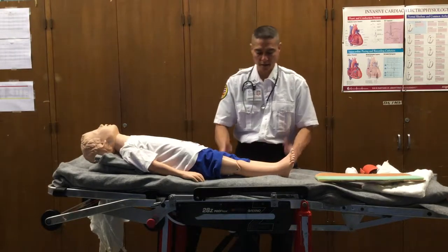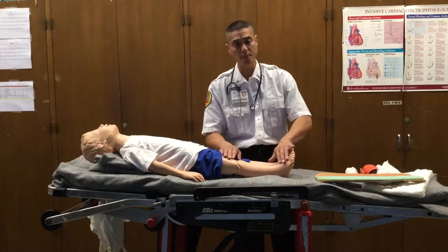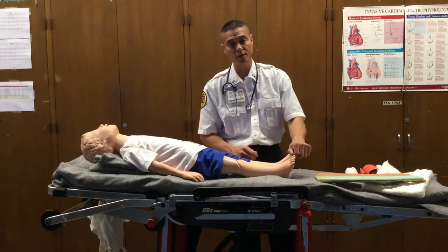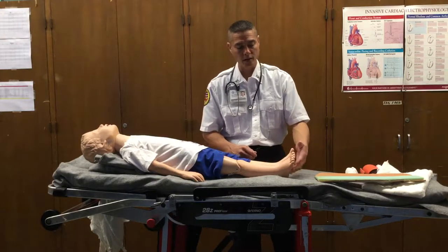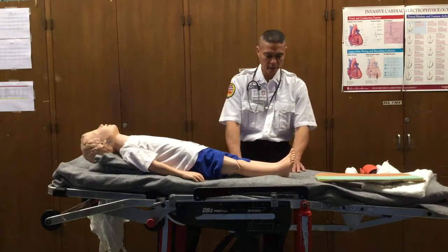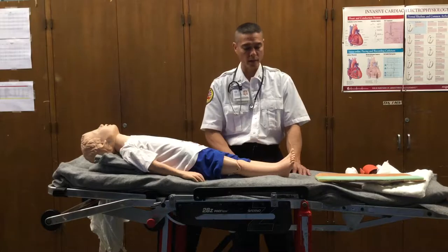While one partner measures out the splint, the other partner needs to check the distal parameters of the affected injury. That means checking the pulse — the dorsalis pedis and posterior tibialis. You want to check these pulses, capillary refill, skin color, temperature, as well as sensation: can they feel this? Does it feel the same? And whether or not there's any movement. So pulse, motor, and sensory — as well as color, temperature, and swelling — when evaluating the extremity.